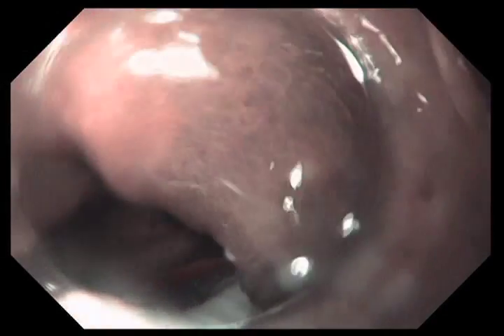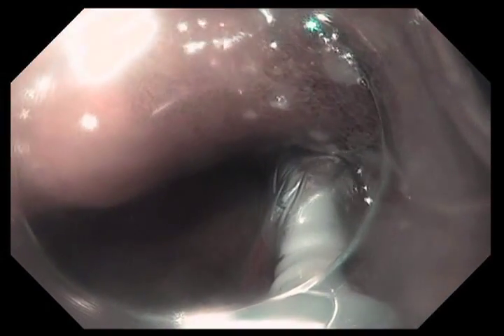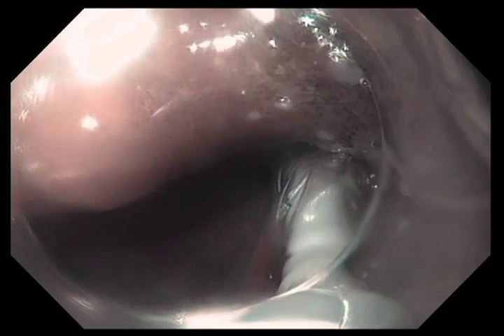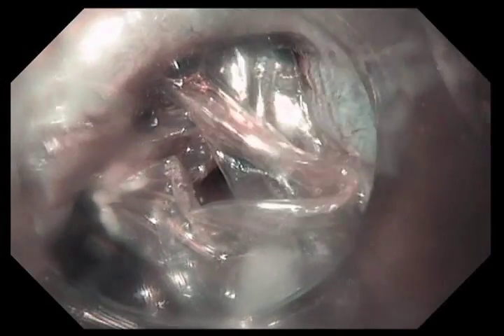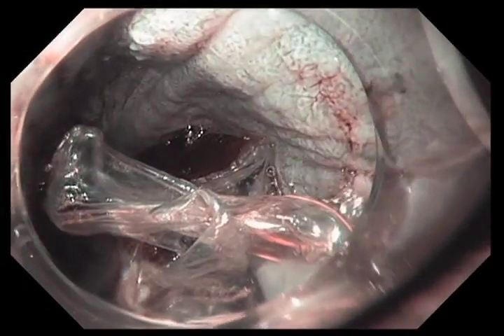We've now switched to NBI. This allows me to position the treatment catheter a little bit better — I can see where the mucosa is. Once we get the treatment balloon positioned properly, one pedal on the machine inflates the balloon — you can see the balloon being inflated right there. I'm now going to aspirate all the air out of the lumen, and then as soon as the machine tells me the balloon is completely inflated, I hit the treatment pedal. It takes about one to one and a half seconds to deliver the energy, and then the balloon is deflated automatically. You can see the area I just treated and the white coagulation that's been produced.